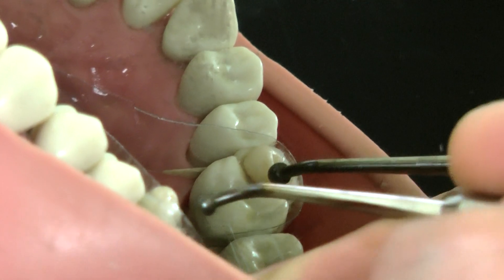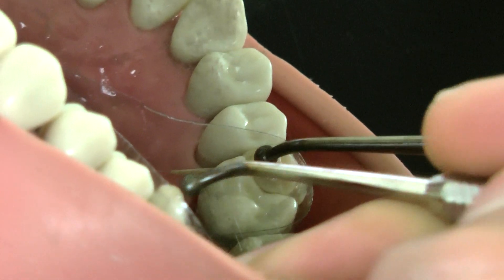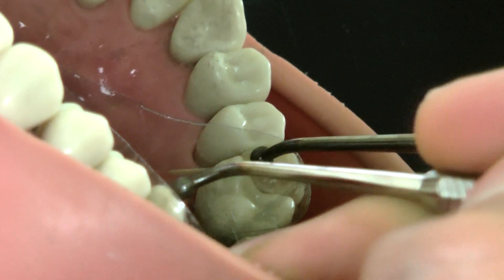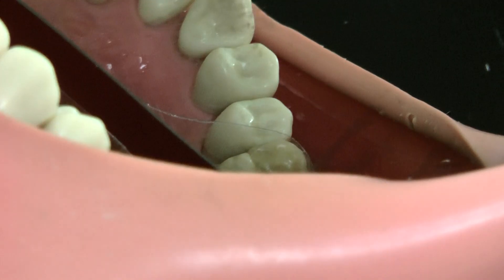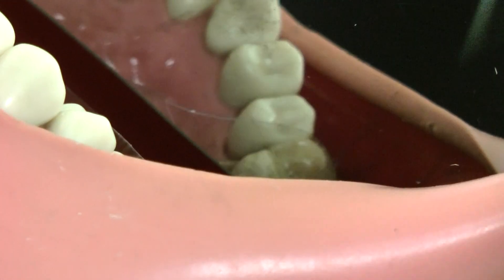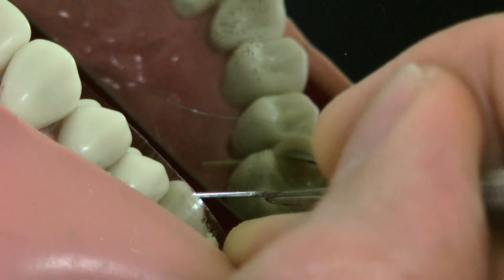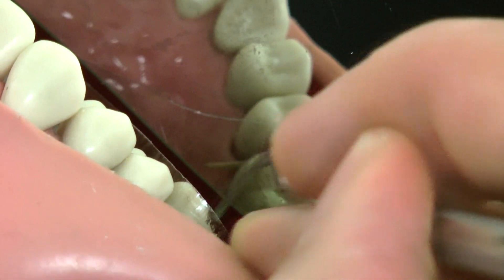Now I'm adding the last layer of composite. When I add this layer I'll try to give it a little bit of shape, although that's not a big deal because we shape it with the bur. Always slightly overfill it, then grind it down with the bur at the end. I can mark where the marginal ridge is and give it a little shape to the cusp and the buccal fissure as well.